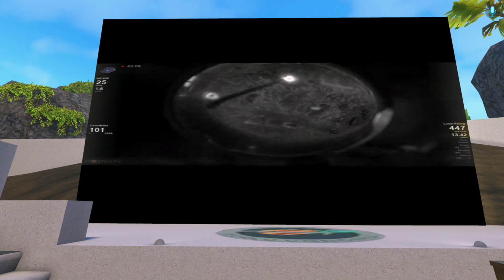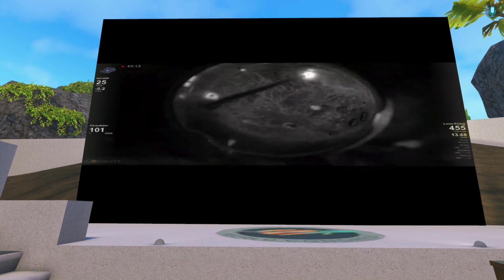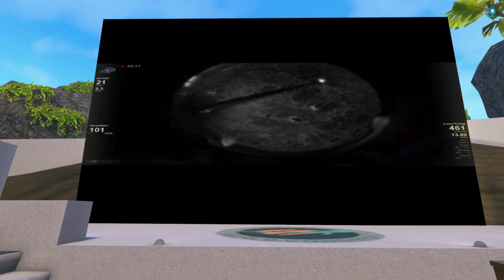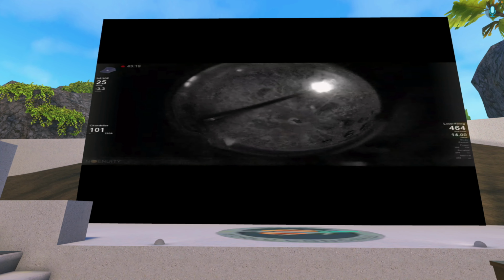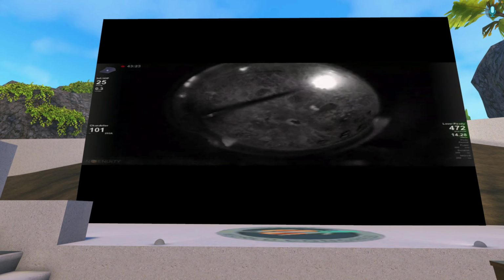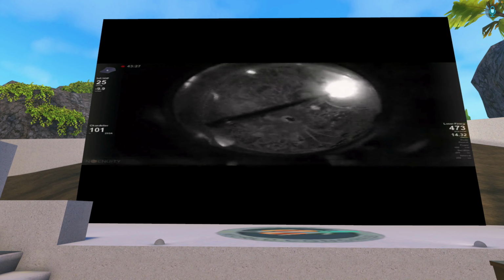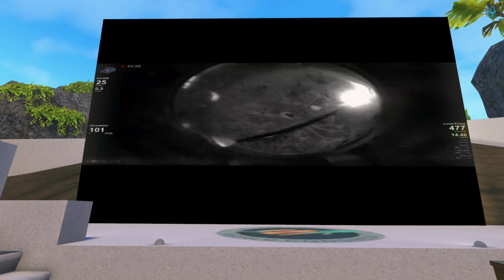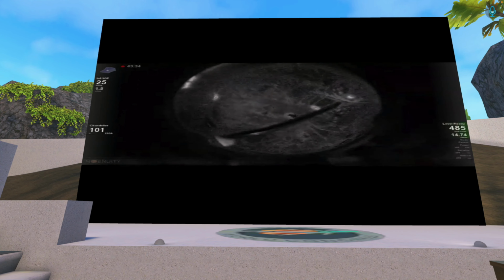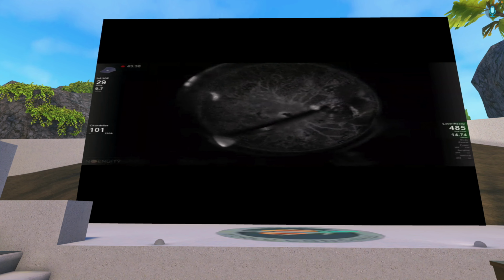So as I said, I played with the different color settings and I gave up, meaning now my main aim is to achieve as much contrast in the image as possible, because when you have contrast, and basically here this is a dark white contrast, you will achieve better separation of the details. I agree completely. This is my personal opinion.